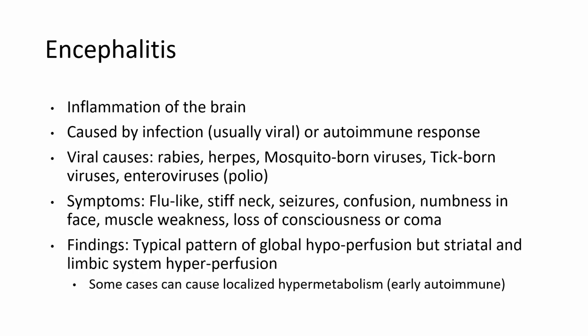Same thing with Hashimoto's and the thyroid gland, because Hashimoto's is autoimmune. You have what will appear as hyperfunctioning at the beginning stages because there are more inflammatory cells rushing to the area. So you have all this inflammation there.